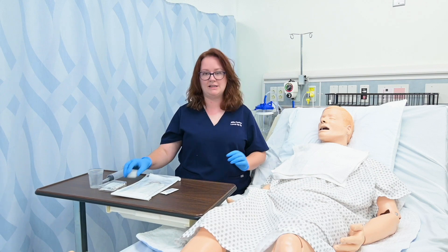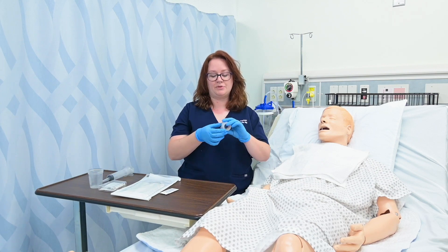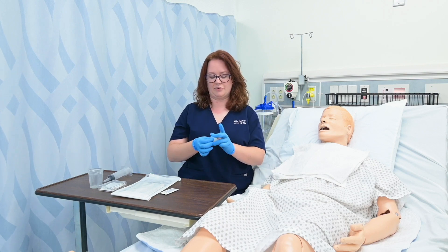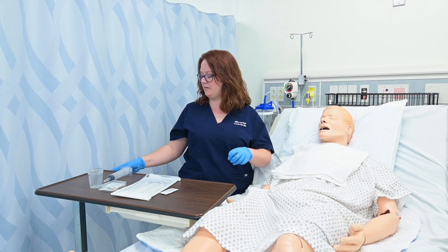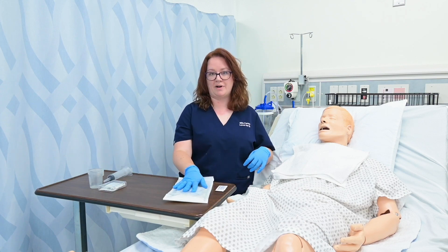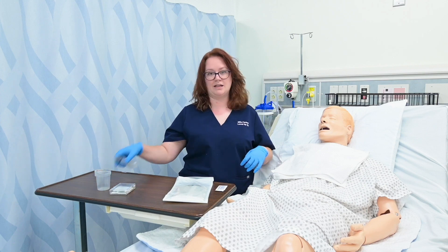Before I start the procedure, I like to get some tape prepared because there will be points in this procedure in which I need tape and I only have one hand available. So I'm going to do a couple pieces of tape to make sure they are prepared for use. You can see I've got lubricant, I've got my nasogastric tube, I have pH strips, a container, and a piston syringe.